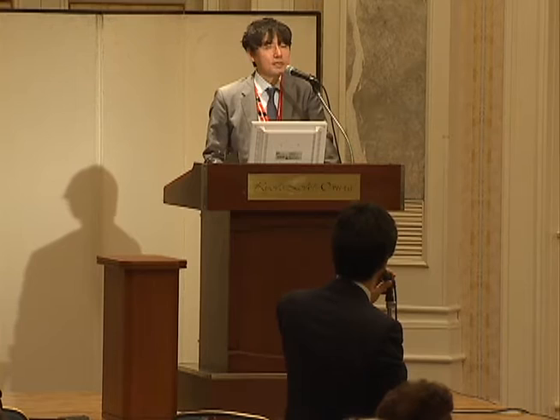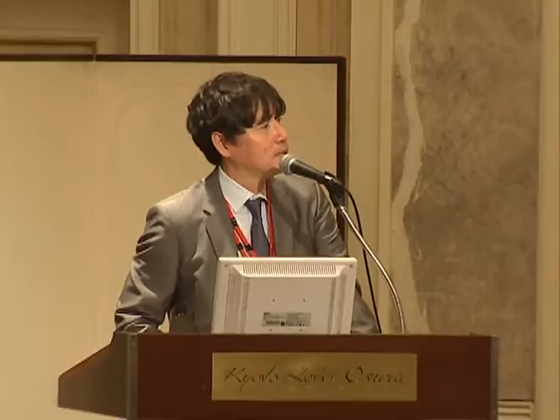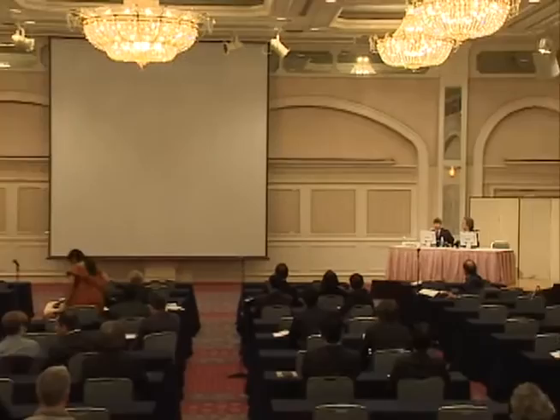Thank you very much. I have a comment. Ask your chairman about the melting of the dentin. Have you seen something before? Losing dentin? No, we didn't. We had resorption of the lamina, but mainly of the bone part. Yes, the bone part. No, at stage two, I found a loose optical cylinder. I was surprised to see. Have you seen that case before?